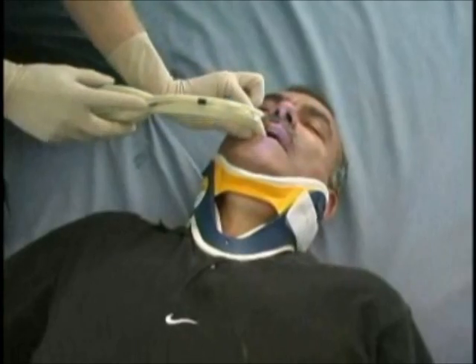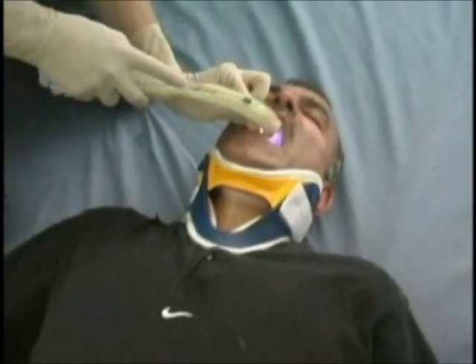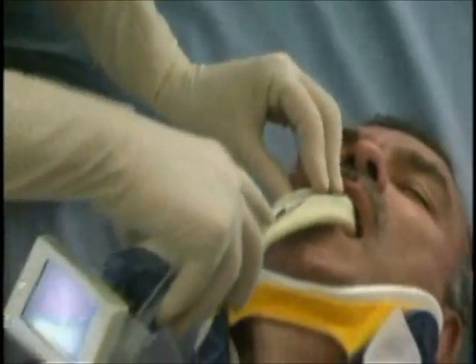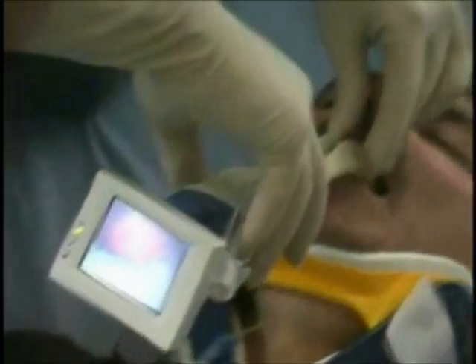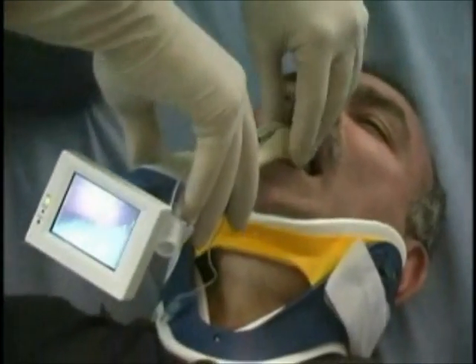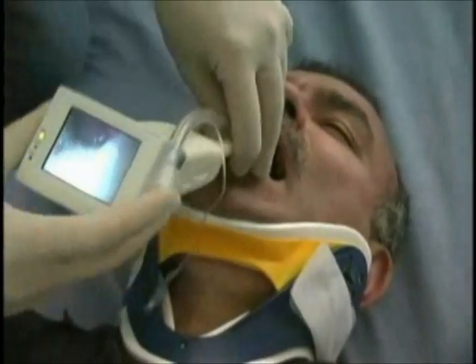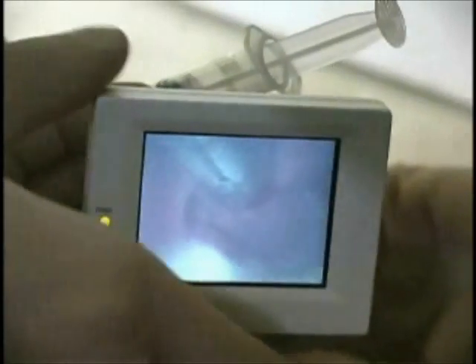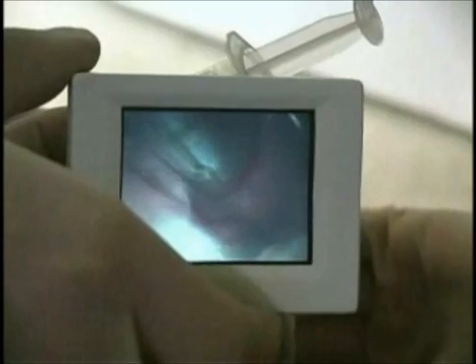The loaded rescue scope is initially introduced into the mouth horizontally, just as with the standard airway, until it reaches the base of the tongue, where it turns to a vertical position and descends near the epiglottis. The rescue scope must be pushed as posterior as possible so that its distal end — the epiglottis sweeper — is assured to descend in front of the epiglottis.